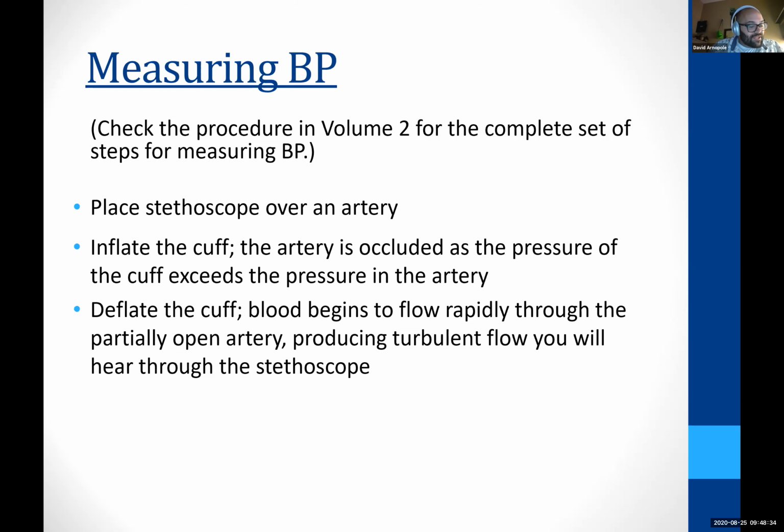And there's a type of blood pressure check, which is actually dealing with orthostatics or orthostatic vitals, where you have to specifically have the patient lying down, flat, check their blood pressure, have them sit up on the side of the bed for 5 minutes. Do not wait shorter. 5 minutes. Then you check their blood pressure again. Then you have them stand, wait 5 minutes, and then do it again. That will tell us if there's a problem or orthostatic tilt, if there's a problem with their blood pressure and heart rate and they can't control what's going on with their body, okay?